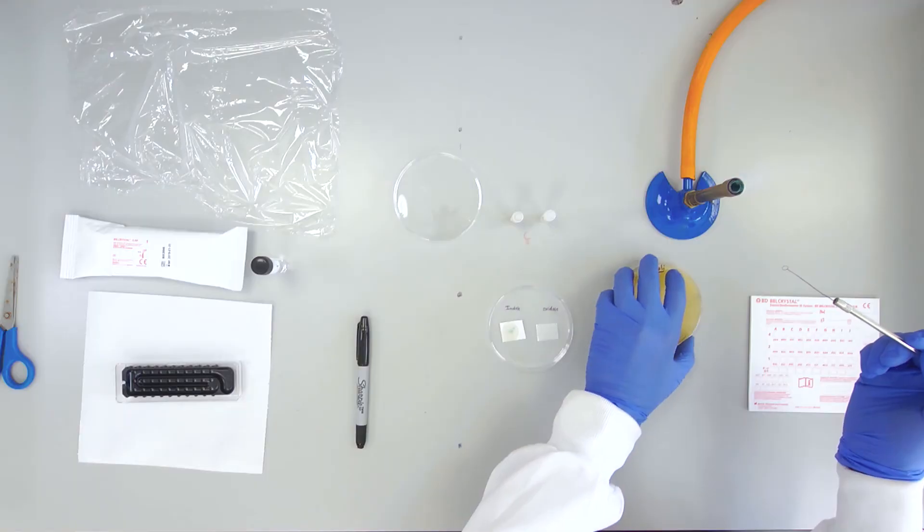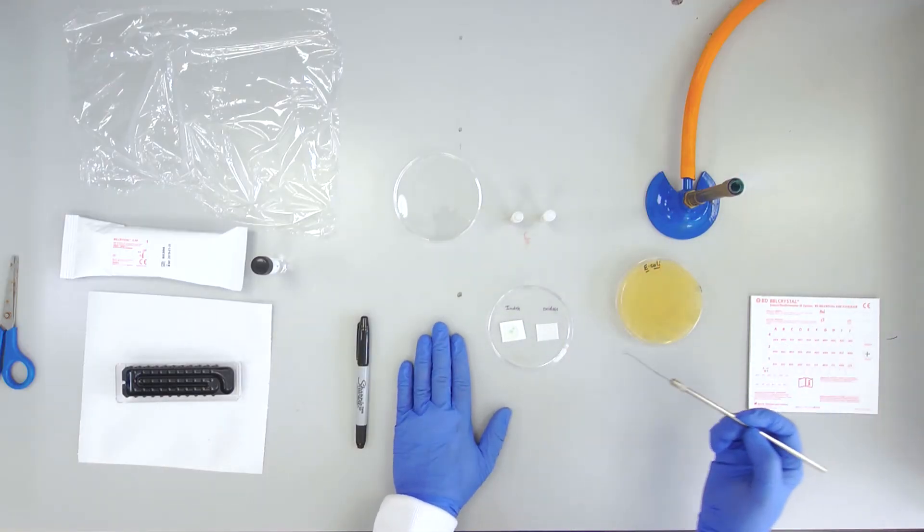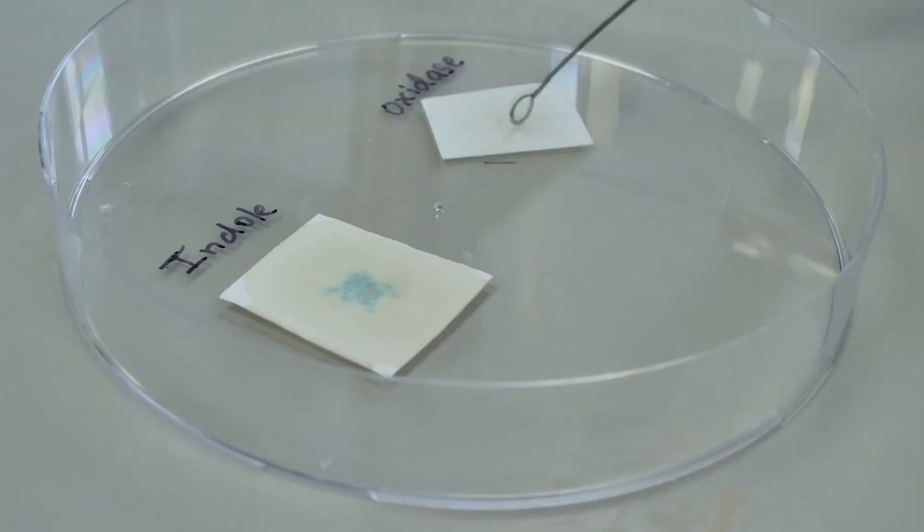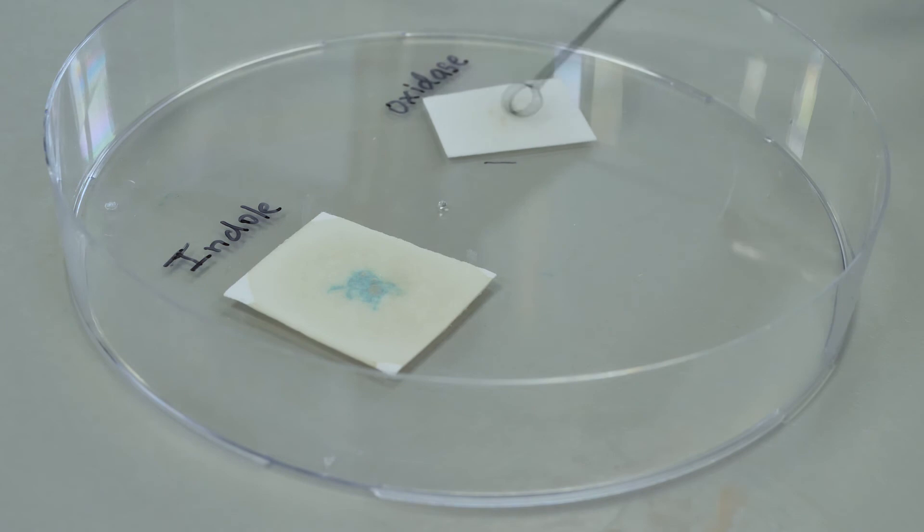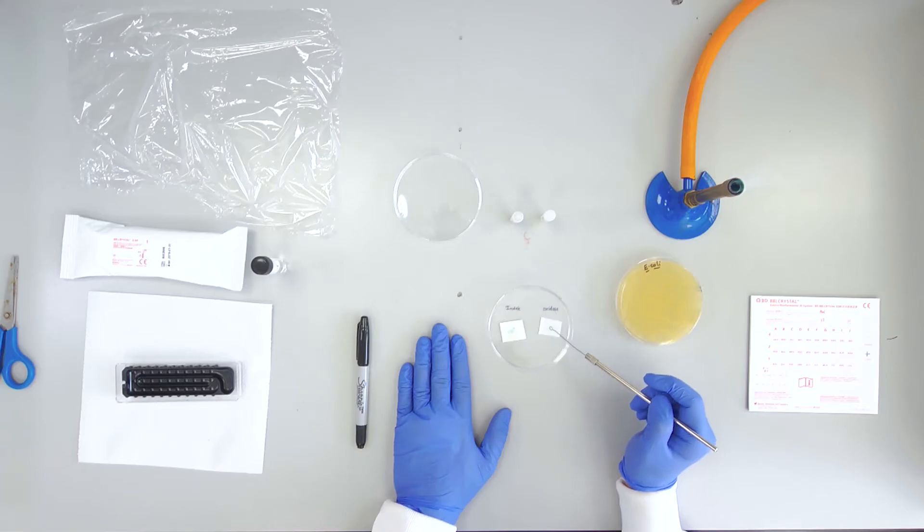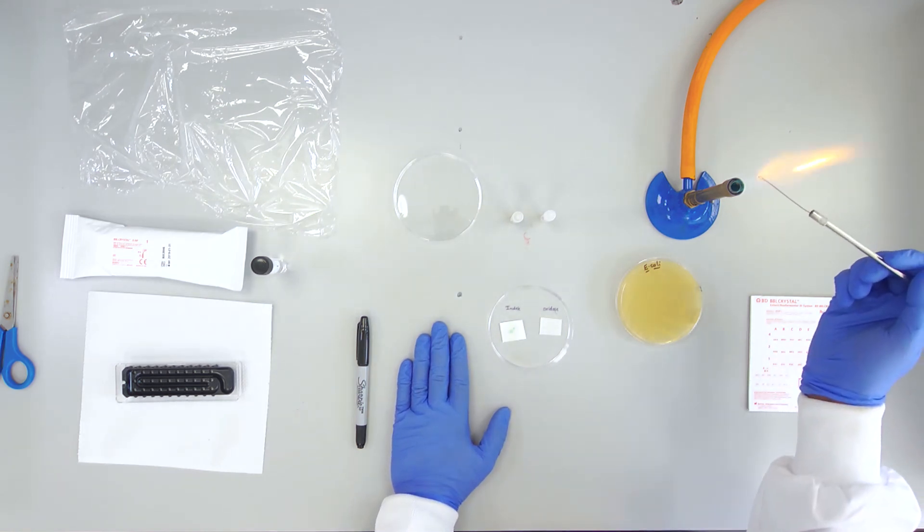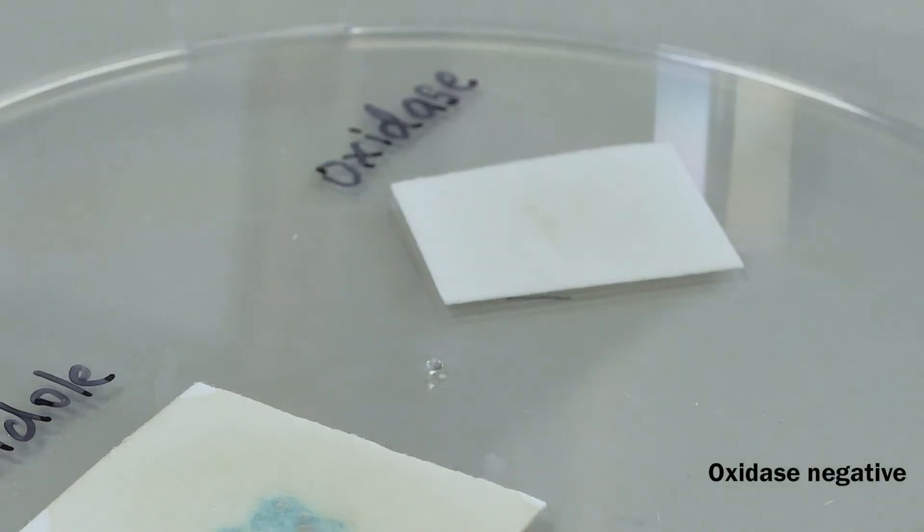A purple violet colour within 30 seconds indicates an oxidase positive result. No colour change indicates that the culture is oxidase negative.